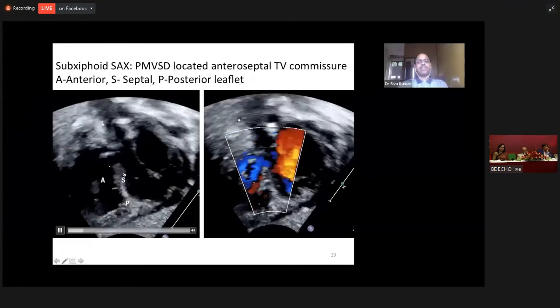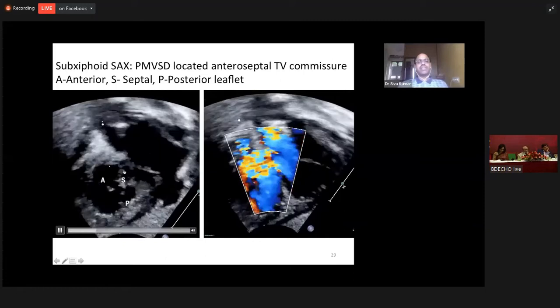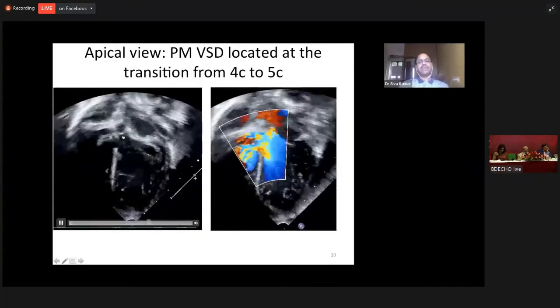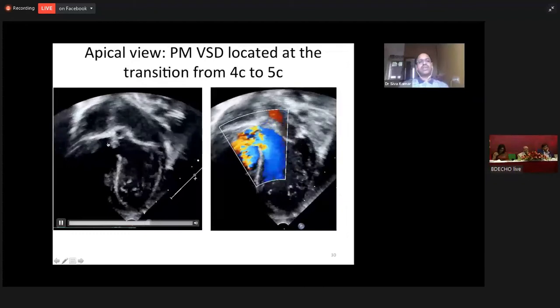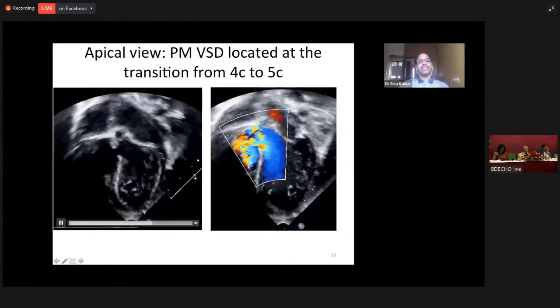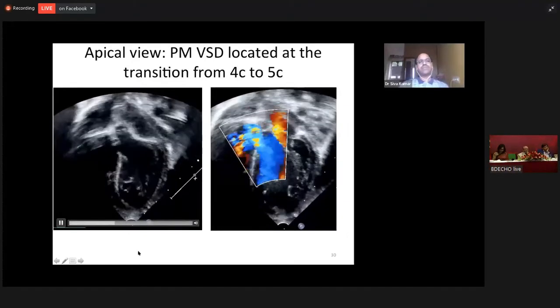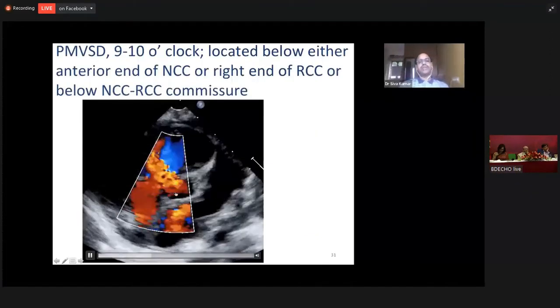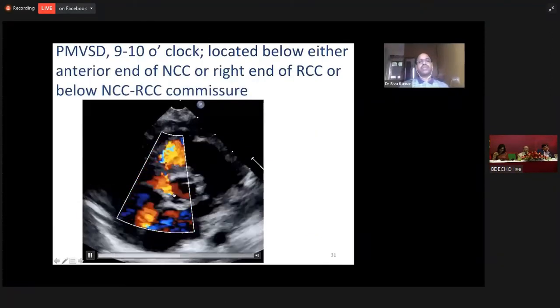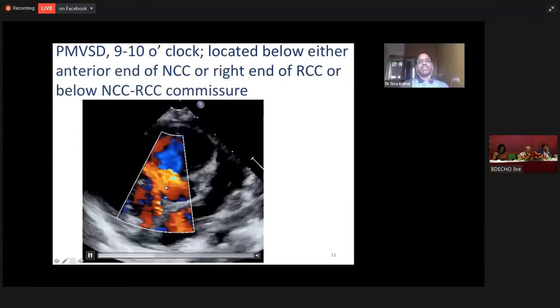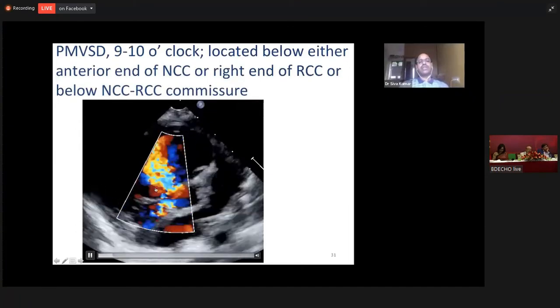When you sweep from four-chamber to five-chamber, at the junction of four-chamber to five-chamber, you look at the perimembranous VSD. So this is the perimembranous VSD when you go from the four-chamber and anteriorly sweep to get the five-chamber view. In a parasternal short-axis view, it is located between the 9 to 10 o'clock position — immediately above the septal tricuspid leaflet.